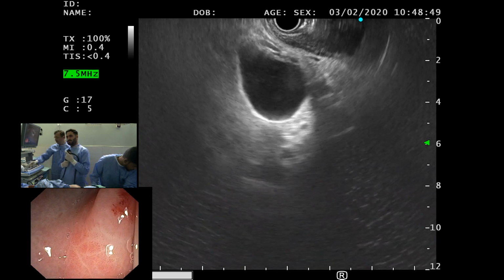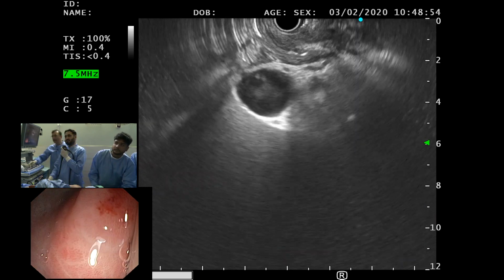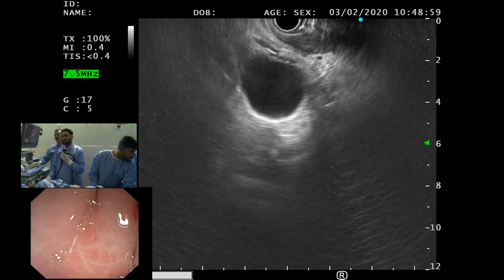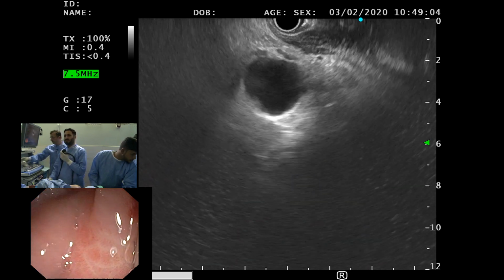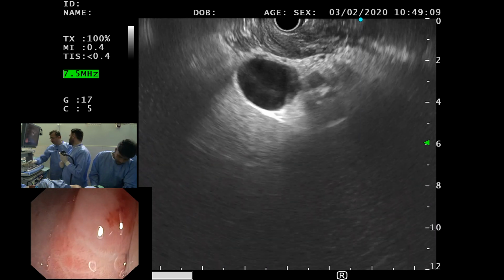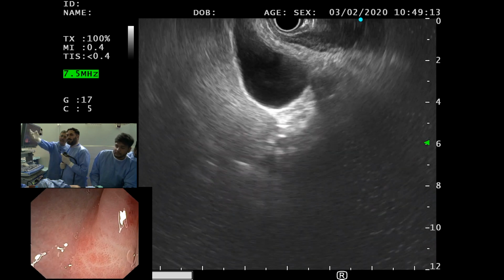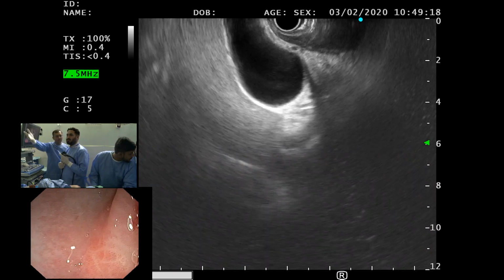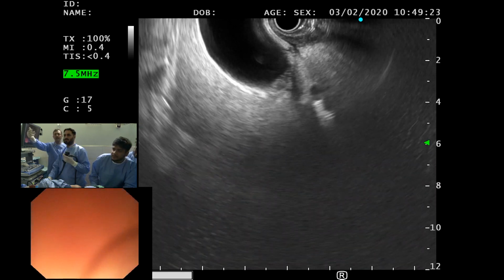It's not spleen, is it, sir? No. How can you say that? Where's the cursor? Oh, sorry. It's not a mass, is it, sir? No, it's not a mass at all. Look, what could this be? This globular thing, which is anechoic, has got bright echogenic walls. It has to be gallbladder. This is gallbladder, right? This is distended gallbladder.